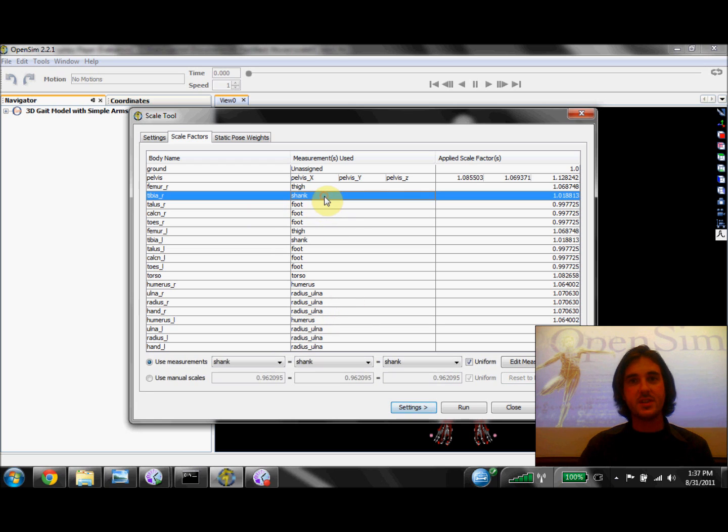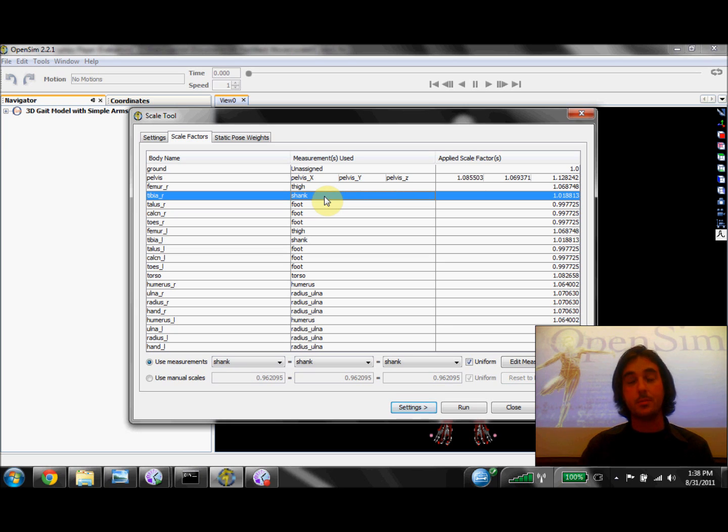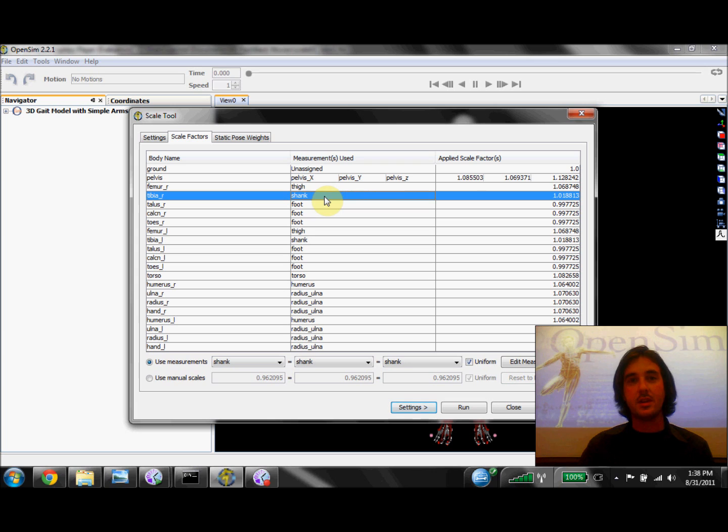For example, for the tibia segment, I've specified a pair of markers that I placed on the knee and the ankle, which I can identify by bony landmarks both on my subject and on the model. The Scale tool will then compare the experimental and virtual markers to calculate that scale factor. And this has been repeated here for each of the segments in the model.